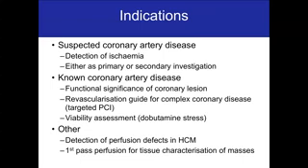So what cardiac MR can offer is testing for the functional significance of such a coronary lesion. It can aid revascularization and guide for very complex coronary disease, for example, to perform targeted percutaneous coronary intervention.